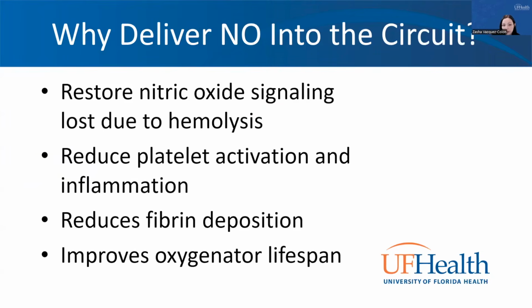Then why should we deliver NO into the circuit? There are certain benefits that have been described in terms of why we should do it. First, it can help restore that nitric oxide signaling lost due to the hemolysis and the scavenging of the NO by the free hemoglobin, reduce platelet activation and inflammation, reduce fibrin deposition, and also improve the oxygenator lifespan.